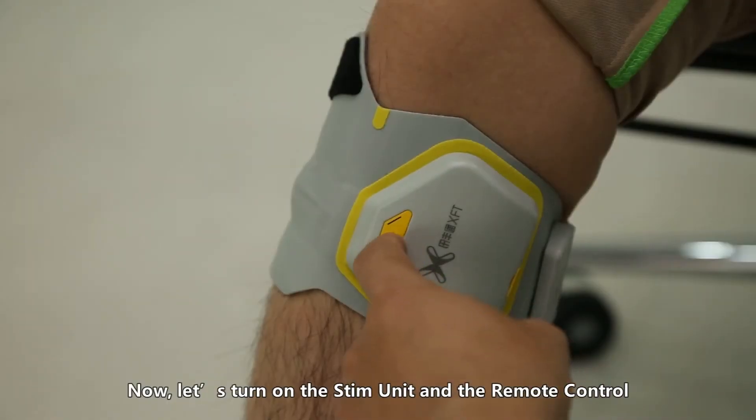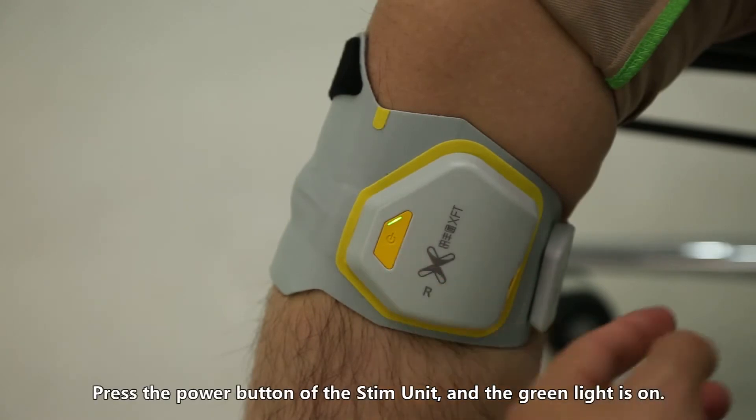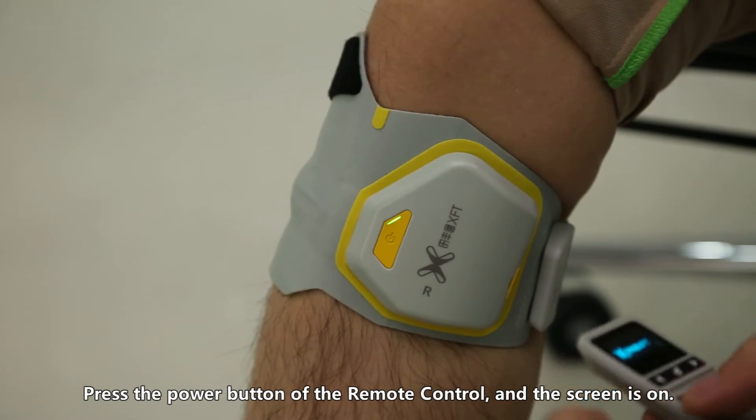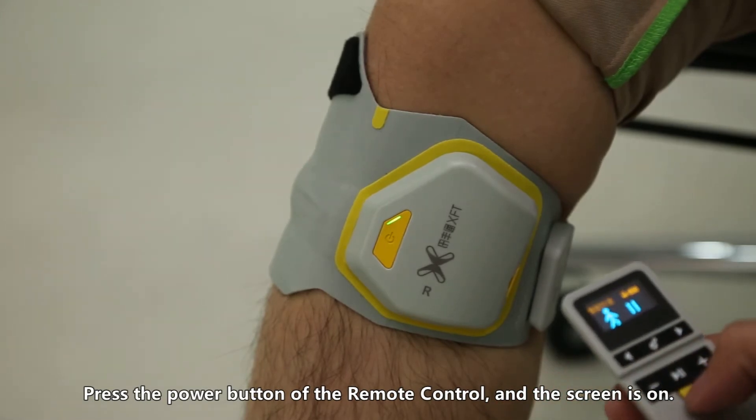Now let's turn on the stim unit and the remote control. Press the power button of the stim unit and the green light will come on. Press the power button of the remote control and the screen will turn on.